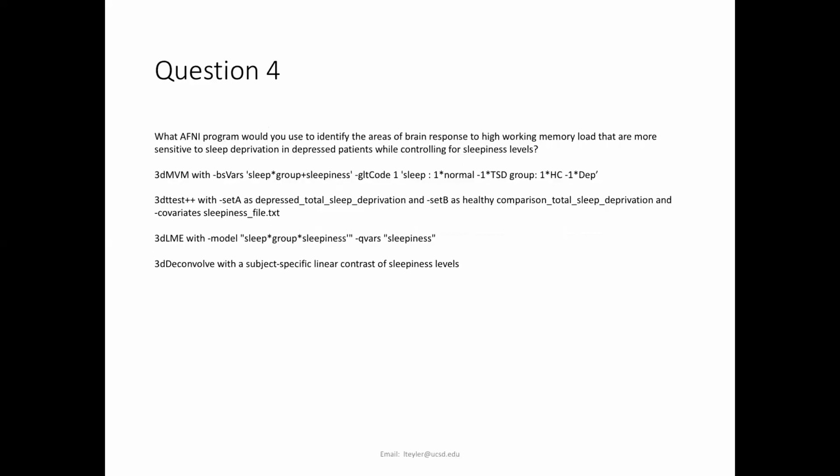Last one, what AFNI program would you use to identify the areas of brain response to high working memory load that are more sensitive to sleep deprivation in depressed patients while controlling for sleepiness levels? So this is that sleep questionnaire that we gave.